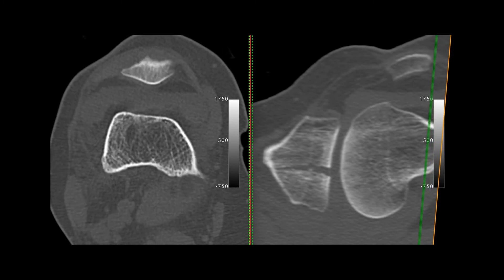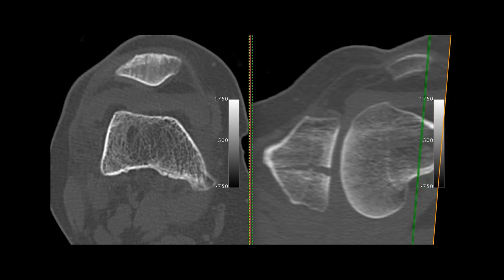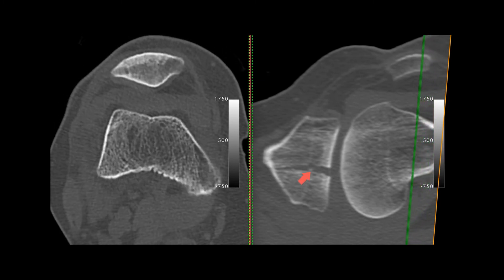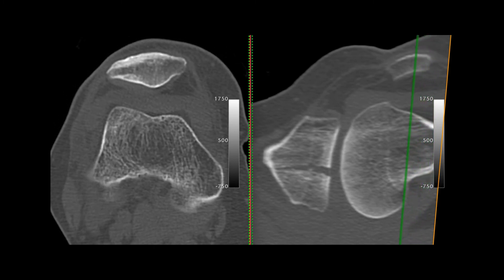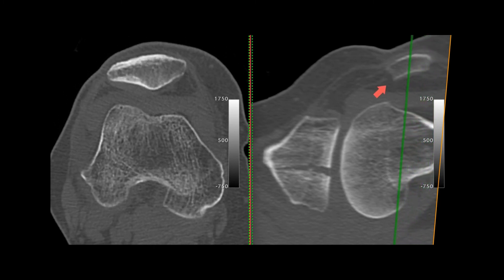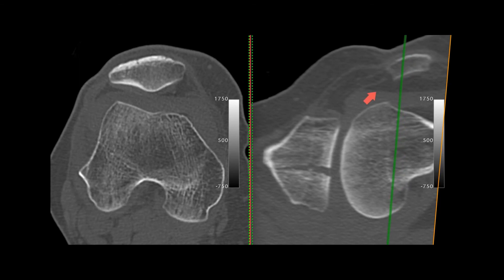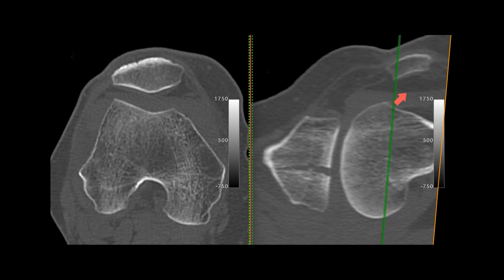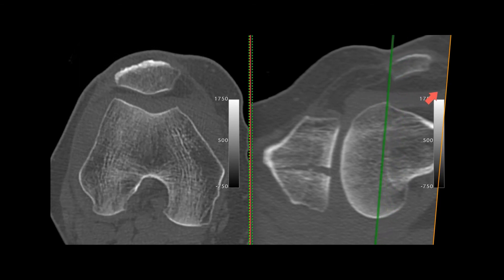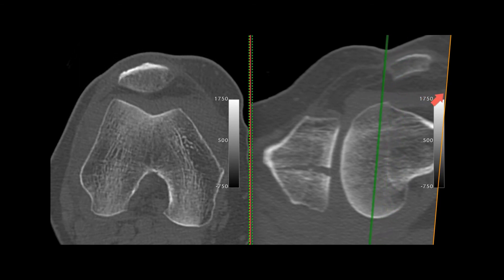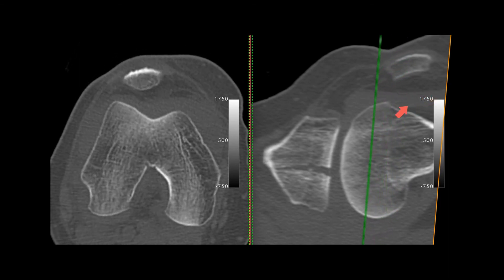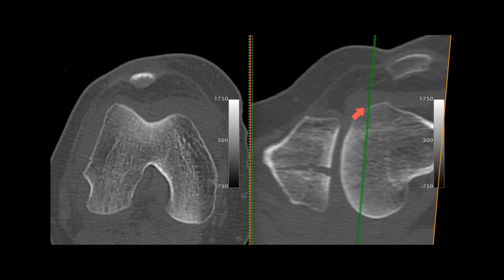This is the CT scan of the same patient. Here is the fracture. There is the fat. There is a straight line, which represents the lipohemarthrosis, with the blood being dependent.